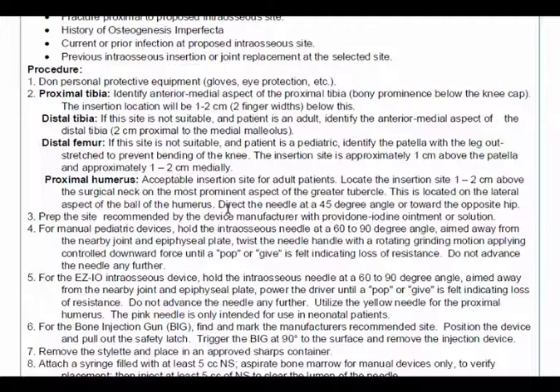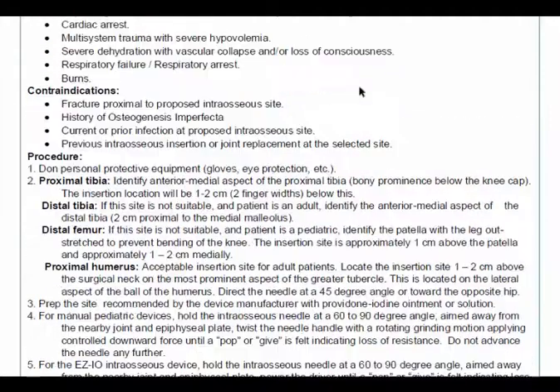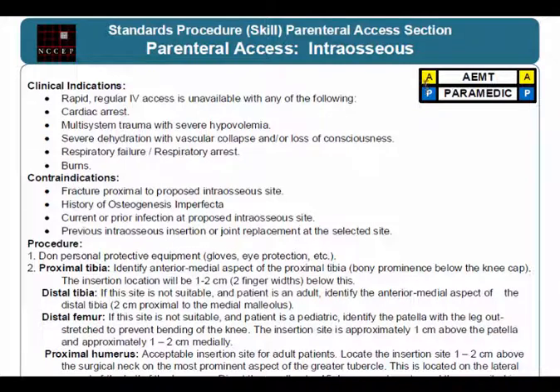that's successful. The other option is to internally rotate the arm, and you could do that by taking tape around the thumb and taping it back around to internally rotate the arm, which gets you better exposure, or you can even take the tape and put it onto the edge of the stretcher, or if you have the patient on a backboard at the time, you can use that. The advanced EMTs will have some specific training regarding the intraosseous access in their transition courses.